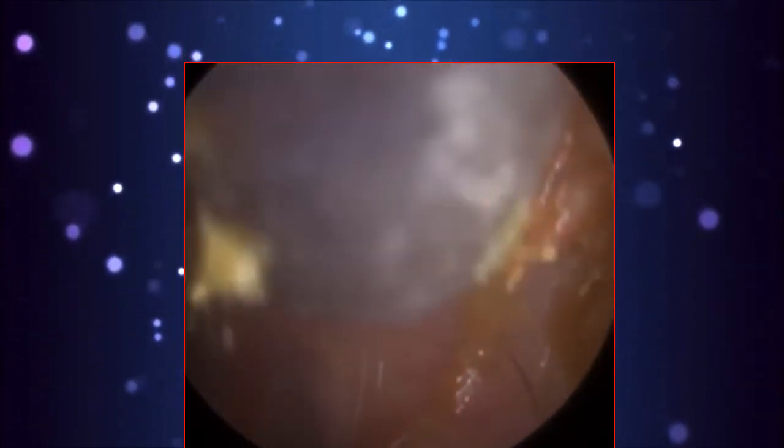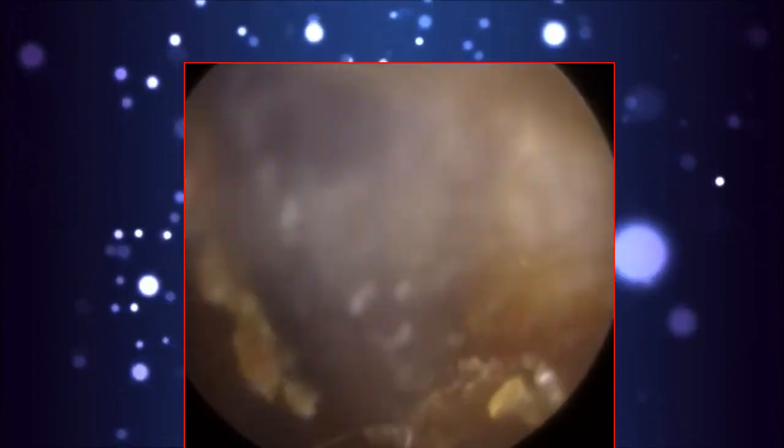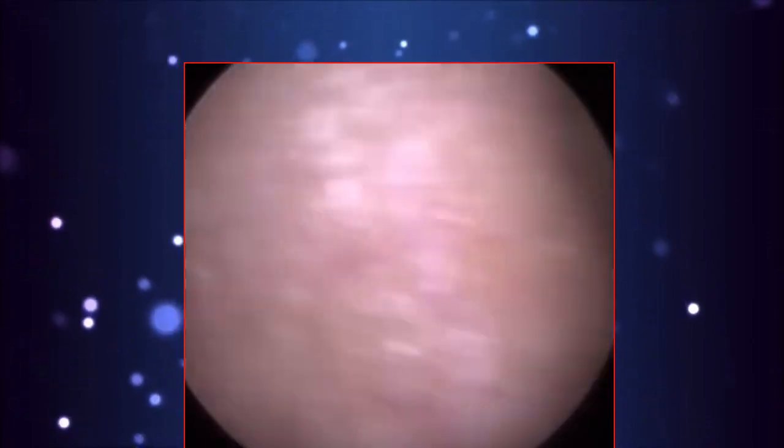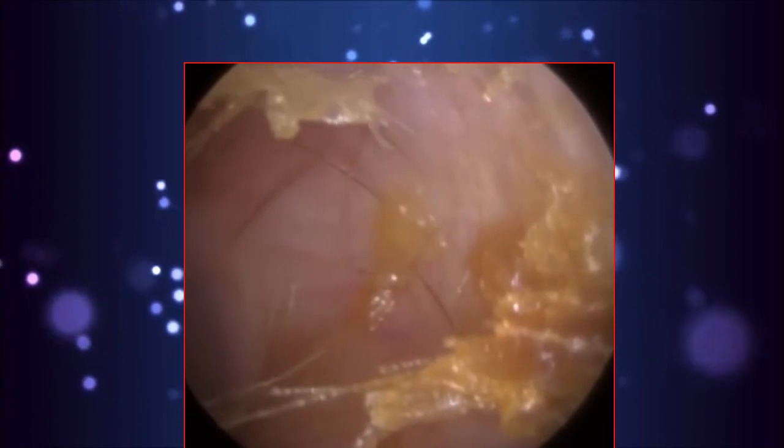Now there's a few loose hairs a bit deeper in the ear, and if you keep watching you will see that I do remove some of those. Now in hindsight, I'm going to be a bit tough on myself. I probably should have left them because I used some forceps to remove it, and because it's on the bony part, and I keep stressing this point on all of my videos and to my delegates.